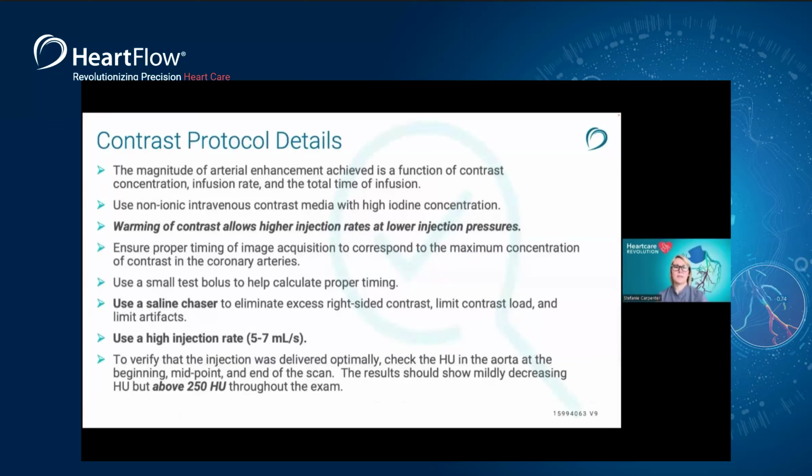Contrast enhancement is essential to differentiate between the small structures in the heart, define the lumen boundary, and view plaque within the coronary arteries. This is also important for HeartFlow analysis so that accurate segmentation of the lumen can take place, and in turn, quantitative analysis can be provided.